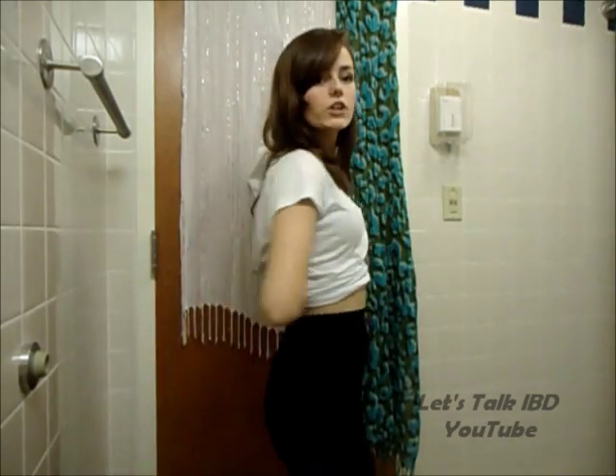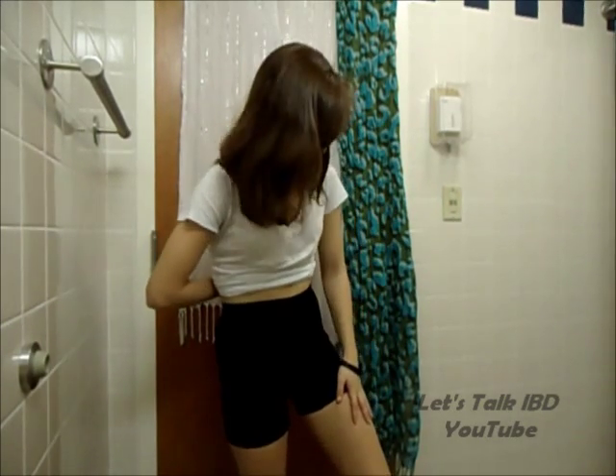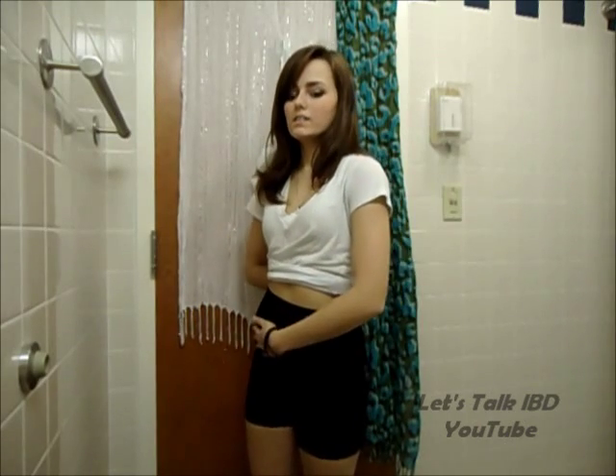Let me show you when I turn around. They come up to — I wouldn't say mid-size, a little bit higher than that. And they definitely smooth out — you can't see my ostomy at all.